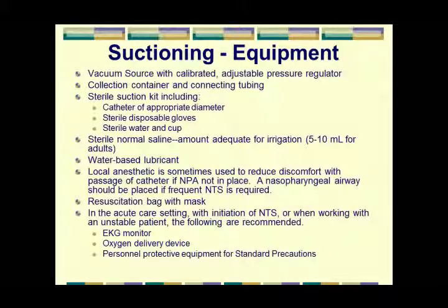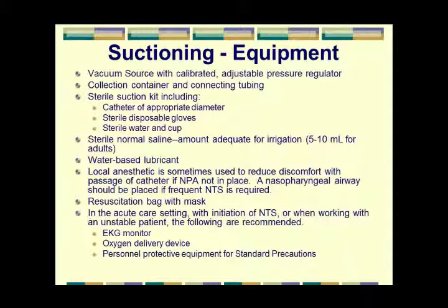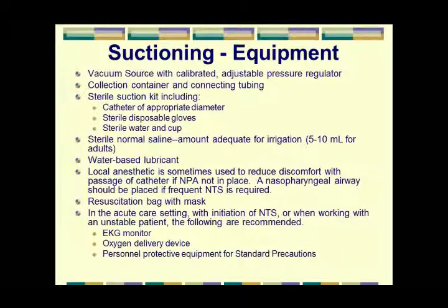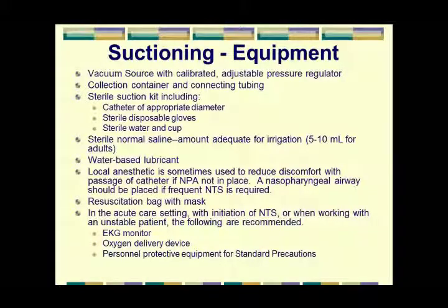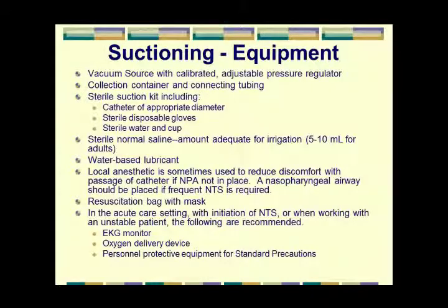You should always have resuscitation equipment nearby, as well as some other monitoring device like EKG and certainly an oxygen delivery device. And Mary talked about standard precautions previously, recognizing that patients you're suctioning always have the potential to generate a cough at just the right moment and have projectile secretions. So I always say stand to the side, don't stand in front.